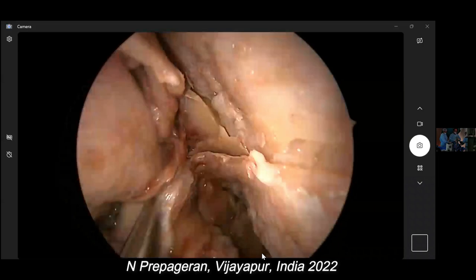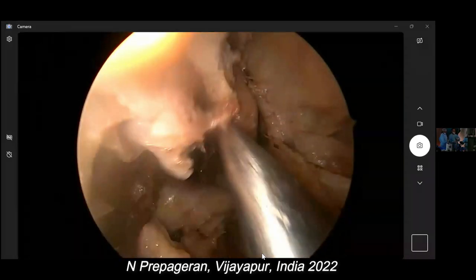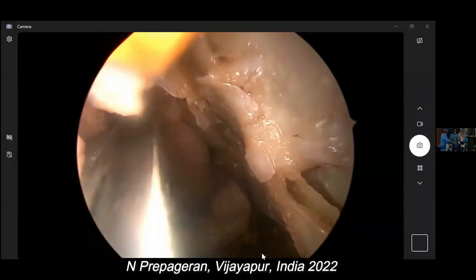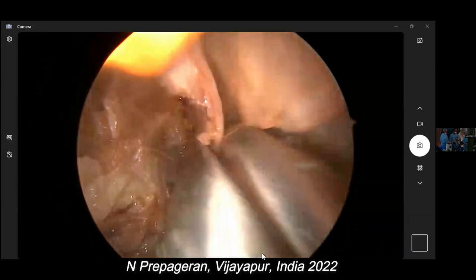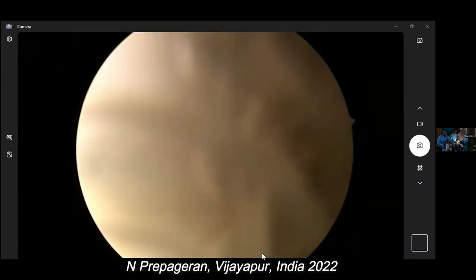Okay? Septal flap done. So to make things easier now, I'm going to cut the middle turbinate so that you have a middle turbinate flap as well. So now you have a septal flap and a middle turbinate flap. Okay, guys? Now, oops, sorry.